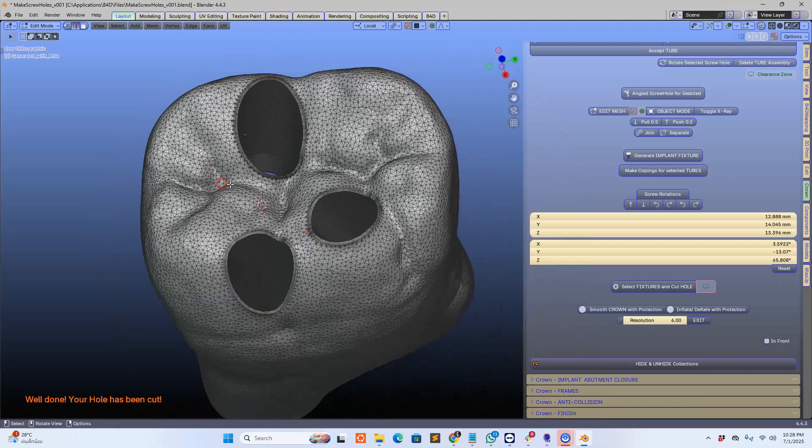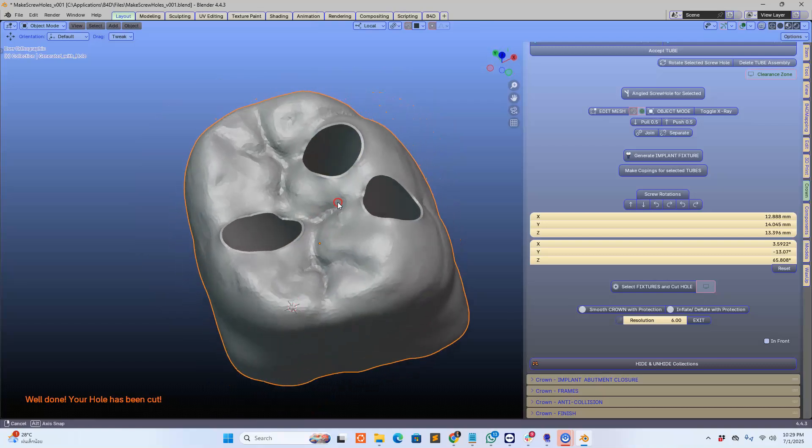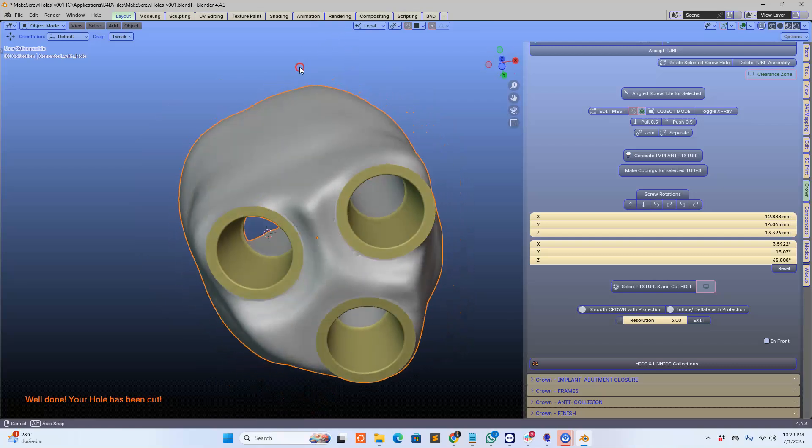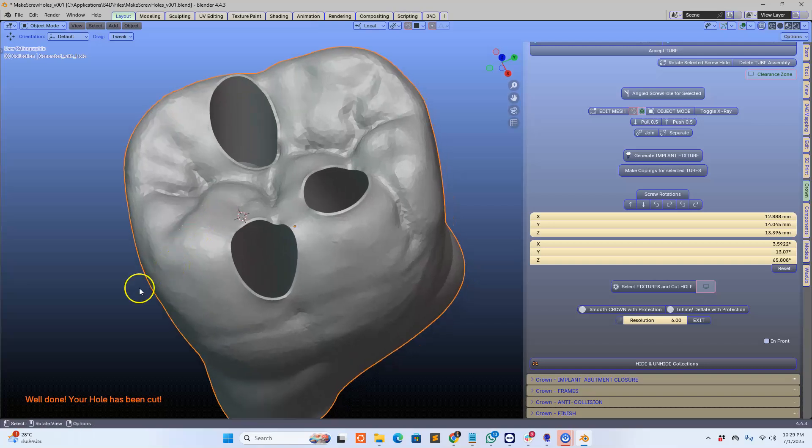Hope you guys like this video. I'll post a few more videos as we go. It shows you and demonstrates the power of B4D in dentistry. Cheers, thank you.